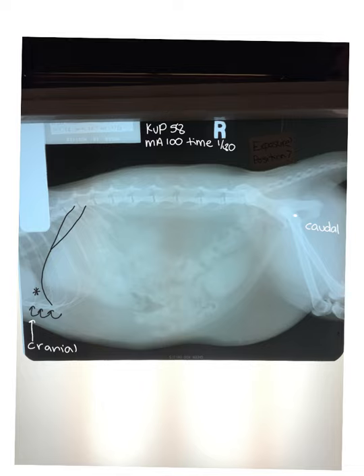If we look back to our caudal landmark, I have a little dot drawn on the greater trochanter. Our caudal landmark is in the view. This patient also looks like they're pretty straight. The spinous processes look fairly straight and things look superimposed. So positioning, pretty good for this radiograph.